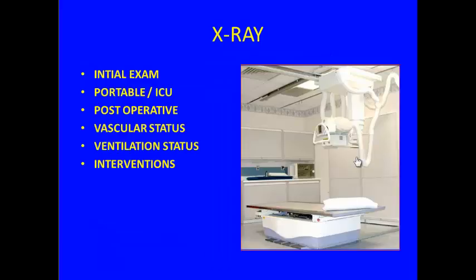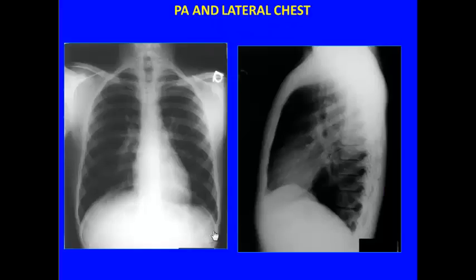Okay, so basically x-ray, we're going to talk about that. That's a great initial study. Why is that? Well, portable ICU, you see that it's great for post-operative patients, and we can assess vascular and ventilation status, and we can drive some of our interventions. What kind of exams do we get?